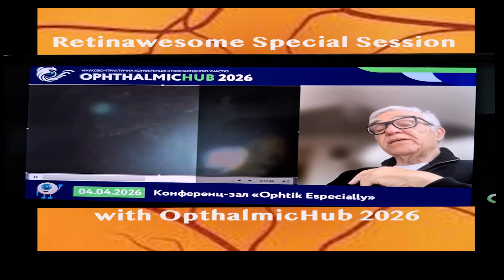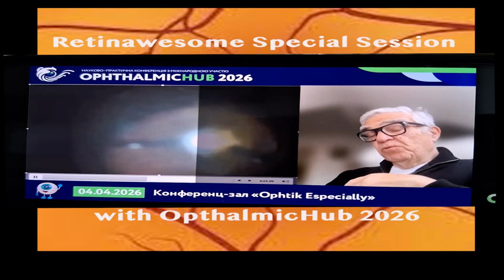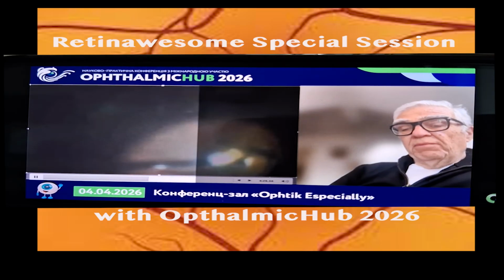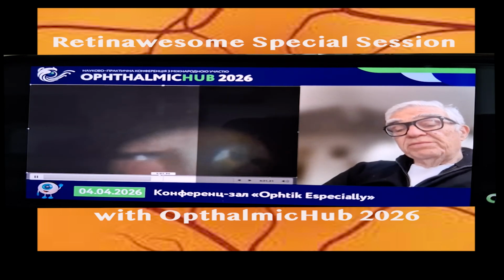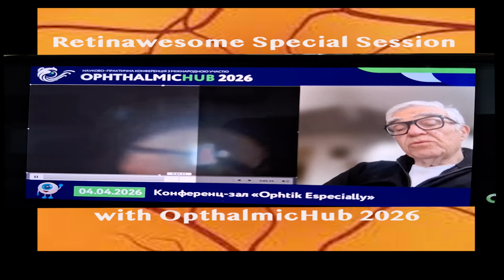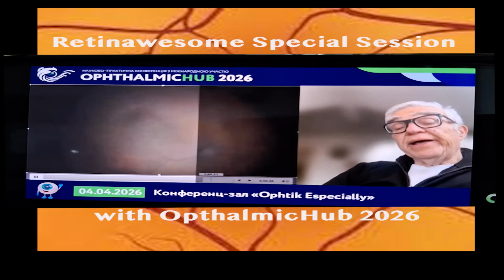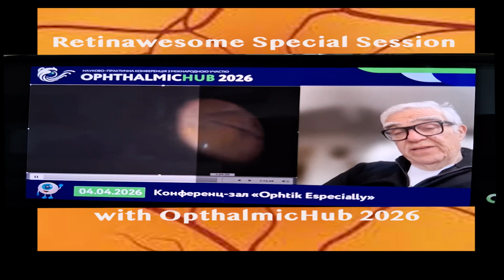And at the end, you make small pieces and you take them by being patient and you remove everything. And if you remove the nucleus to fix the retinal detachment, it's very easy. But we thought that was it. We made it. We fixed it. Let's go a little bit sooner. And at the end, it's clear. The retina is attached.